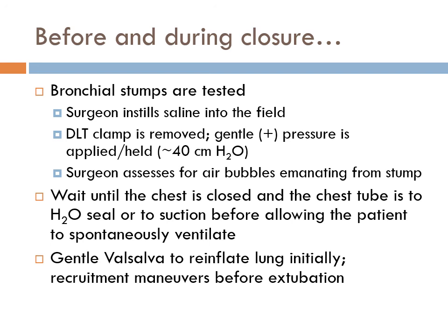So what would happen is you would still be ventilating whichever lung you want, and then the side that they want to just slowly open to test some stump pressures, use your Mapleson circuit. Put it on. In this case, you probably would have to put on oxygen because there's probably not a lot of ports available, but you could go find a tank of air. I mean, go for it. And you could just slowly close your pop off, put enough flow in there so the bag starts to inflate, adjust your pop off like you would for masking people so you're not giving too much pressure, and slowly start to inflate the lungs. They'll be like, come on, let's go, let's go, let's go.